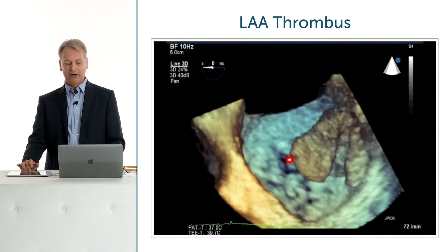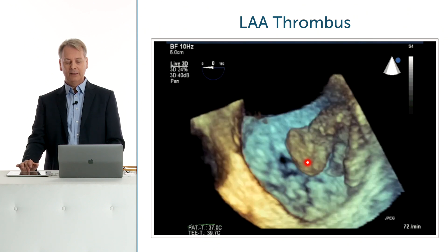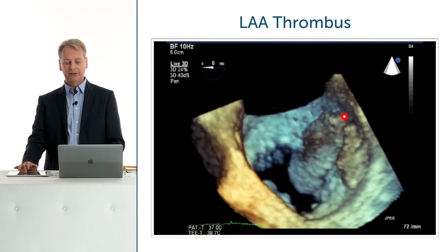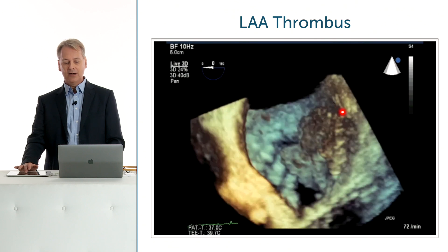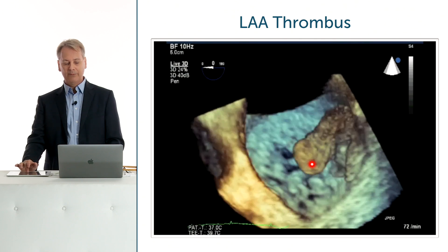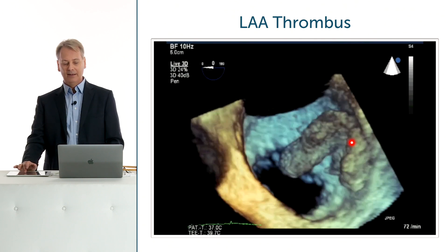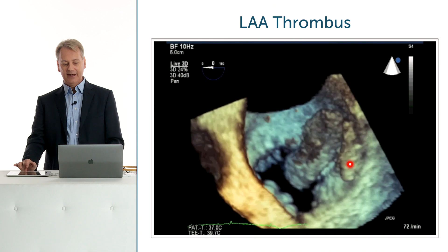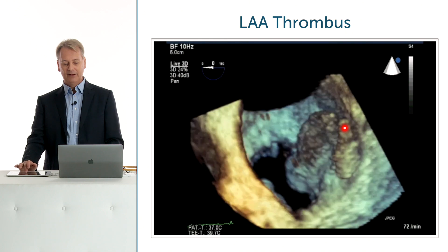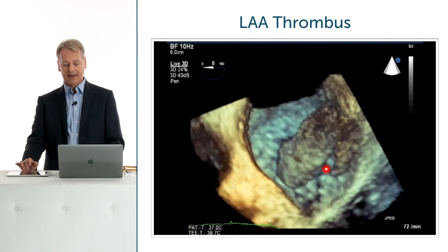A huge thrombus, but what we are able to detect with 3D is that there's not only one thrombus, but actually several thrombi. There's another head here, and probably another one here at the back.